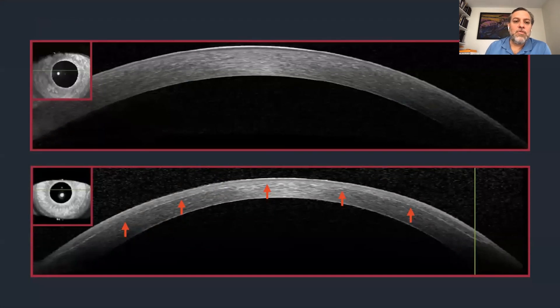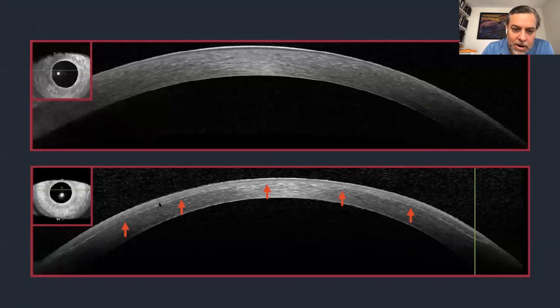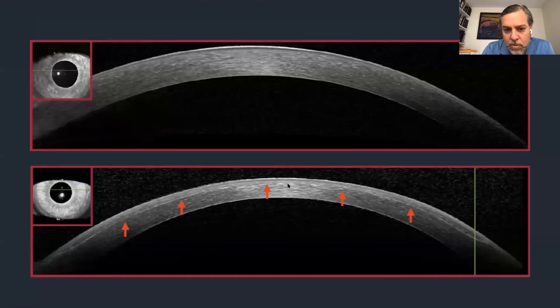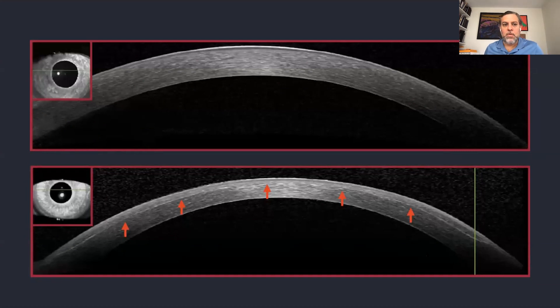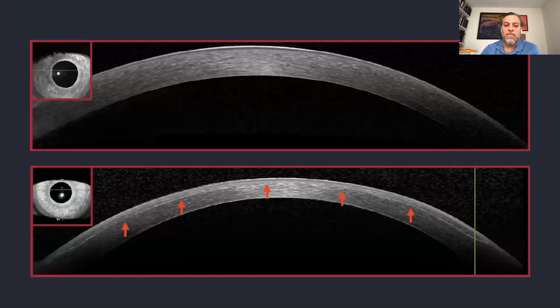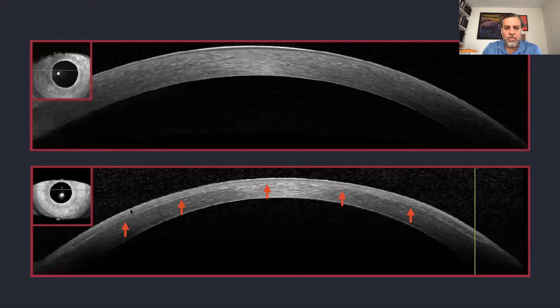With this resolution you can even visualize the LASIK flap — you can see the flap edge clearly. Flaps created with a microkeratome are less regular compared to those made with femtosecond-assisted laser, which appear almost perfectly regular on anterior segment OCT.